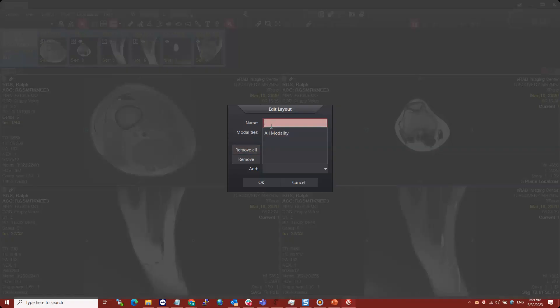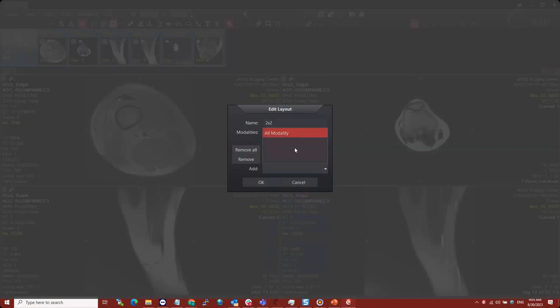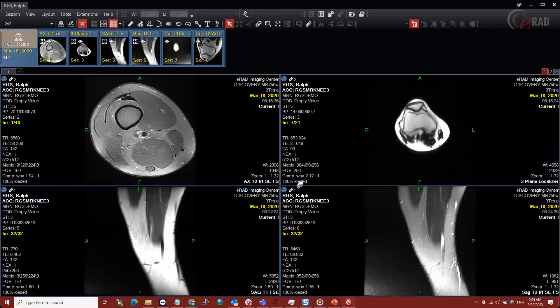I'm going to call this '2 by 2' and leave it set for all modalities, because this is a layout you may use for pretty much any modality. If you wanted to define it for a particular modality, you'd just pick your modality type here and save it with that modality — or multiple modalities. I'm going to save this generic hanging protocol. You can see it's been added to the dropdown.